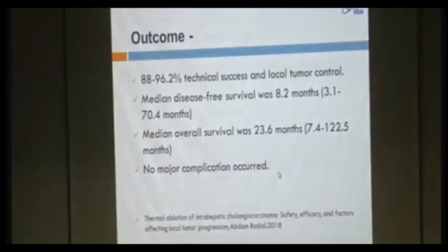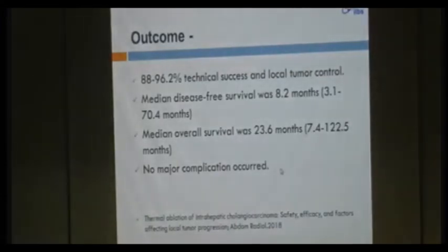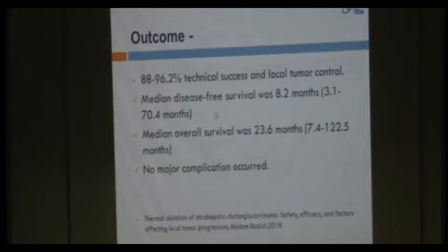So the literature also suggests good technical success and local control of tumor after ablation, ranging from 88 to 96%. Disease-free survival was 8.2 months and overall survival was 23.6 months according to the literature. No obvious complication related to ablation.